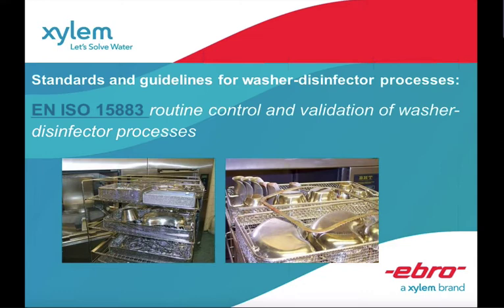And these are guided very much accordingly by ISO 15883, which explains in detail the procedures on routine control and validation of washer disinfector processes.